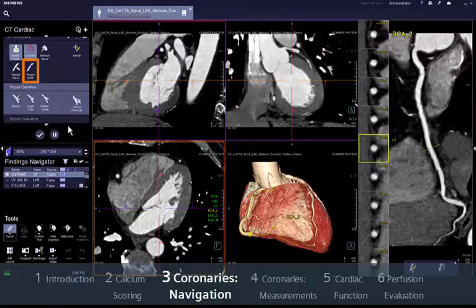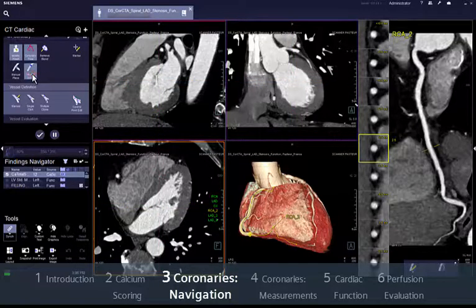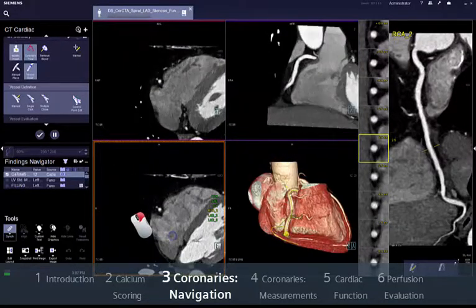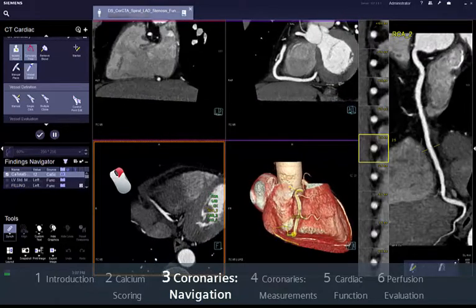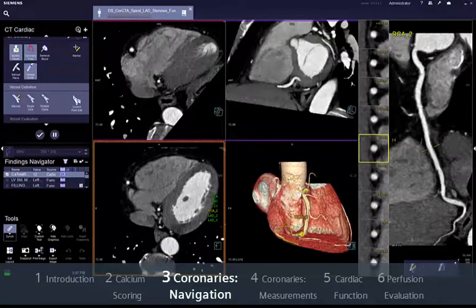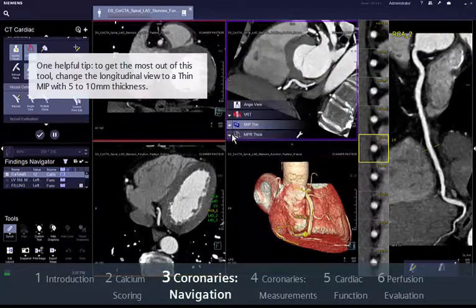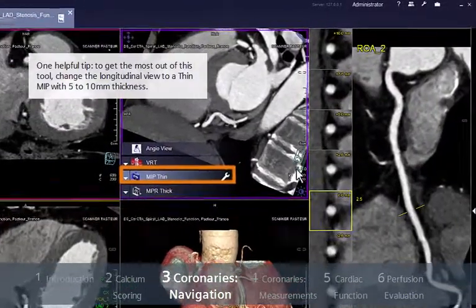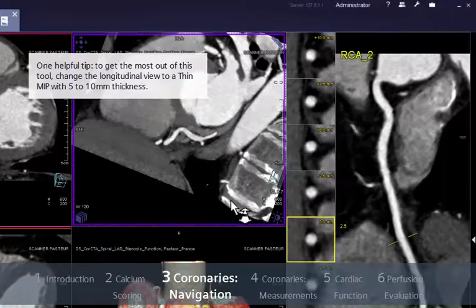To enhance your workflow, the Vessel Surf tool allows immediate 3D navigation even without centre lines or in occluded vessels. Just select the tool, left-click on the vessel you want to follow and drag the right mouse button to surf. The segments will update to display an orthogonal and longitudinal view of the corresponding vessel. A tiny pink point always shows where you are and allows you to rotate around it in all the views. One helpful tip: change the longitudinal view to a thin MIP with 5–10mm thickness.